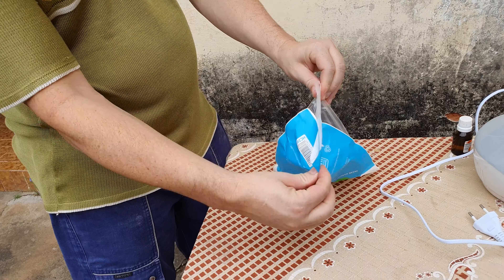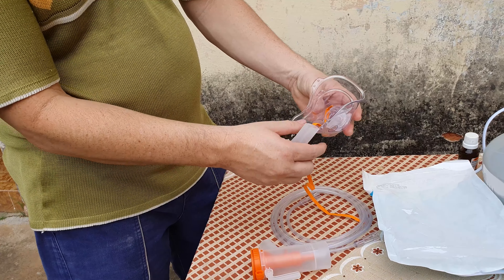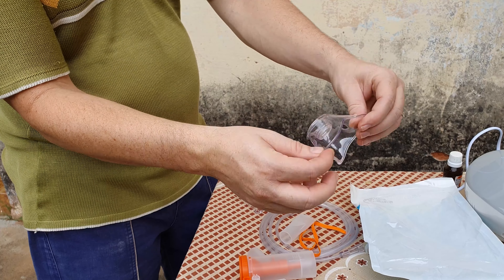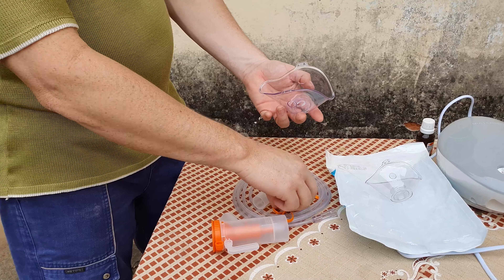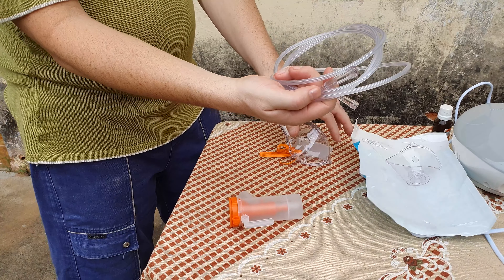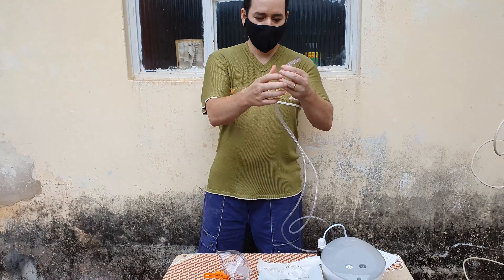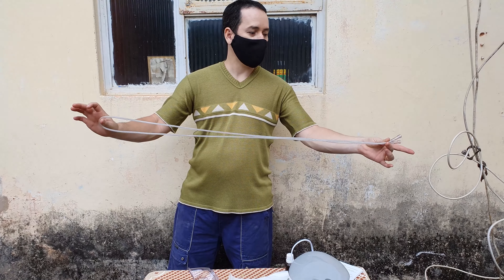Dentro do plástico azul vieram alguns itens muito importantes. Vem o container para colocar o medicamento, que é muito bacana. Ele vem com duas máscaras — uma infantil e uma adulto. No caso da minha irmã, ela é adulto. As máscaras são de um plástico bem durável. Vem com a alça para colocar, tipo um cadarço, e também um adaptador que você pode usar direto na boca. E também a mangueira, que é mais ou menos de dois metros, o que dá muita comodidade para usar o aparelho na cama.